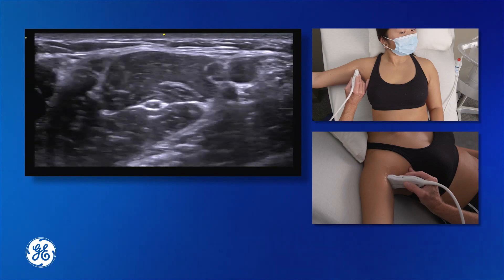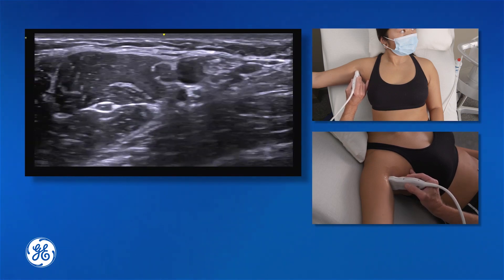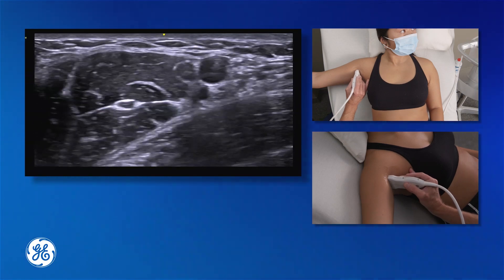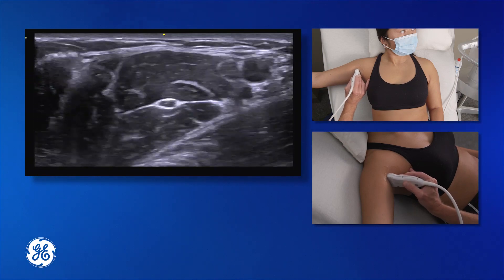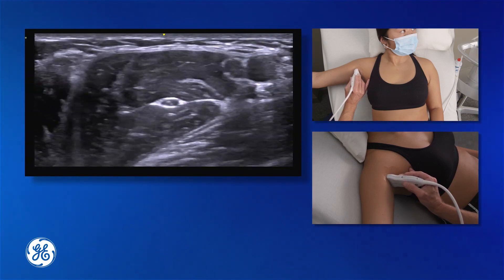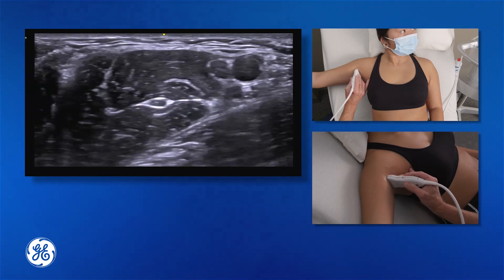We are going to look for our biceps muscle, our triceps muscle below our conjoint tendon, and coracobrachialis, which is going to house most of the time our musculocutaneous nerve. In the center of the screen we can see our musculocutaneous nerve. As I scan distal and proximal, we describe that nerve as swimming like a fish through coracobrachialis. We can see it very prominent here.